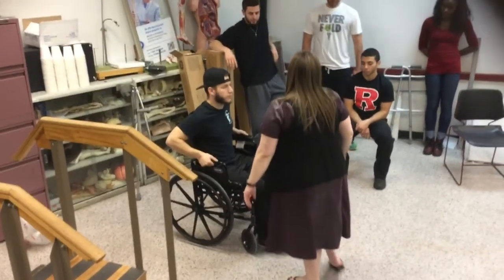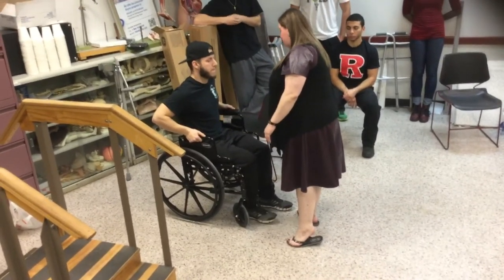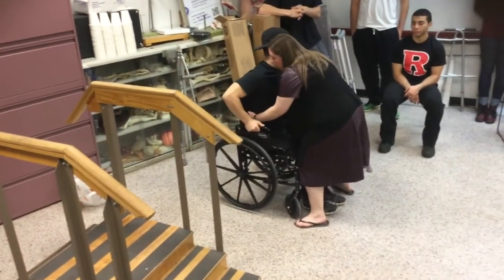Look at mine. So when we stand up, you're going to be standing on only the left leg. I'm going to help you and we're going to put these underneath you so you have a basic support. On the count of three, we're going to move forward.